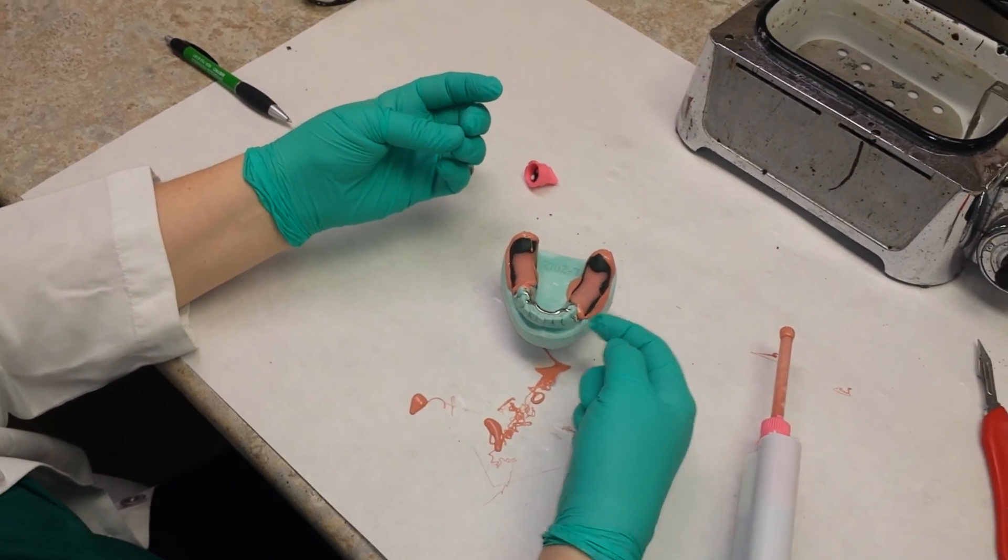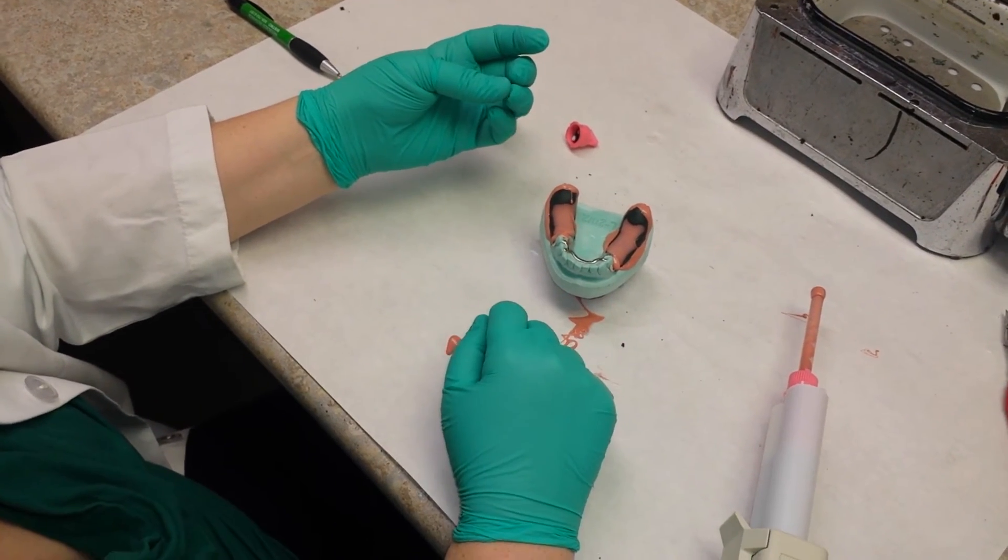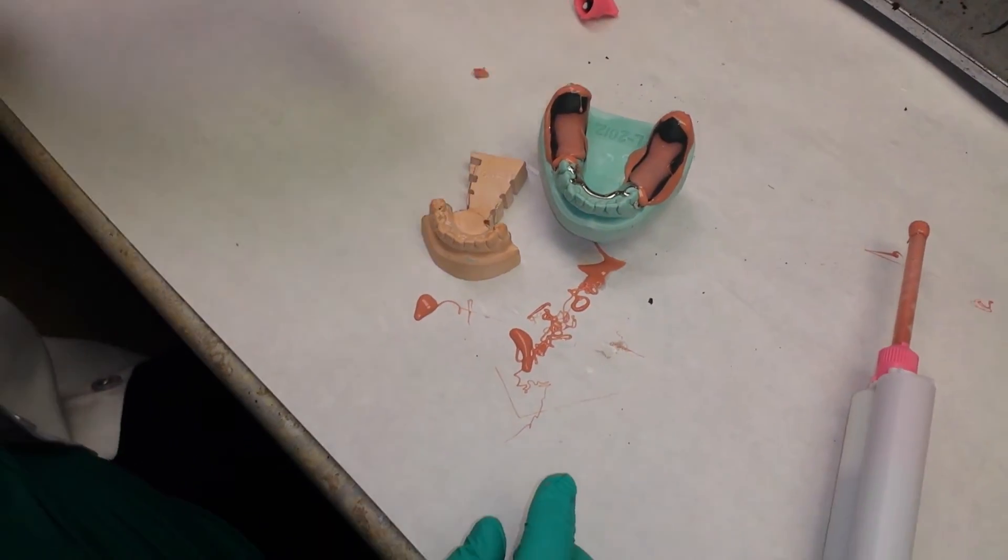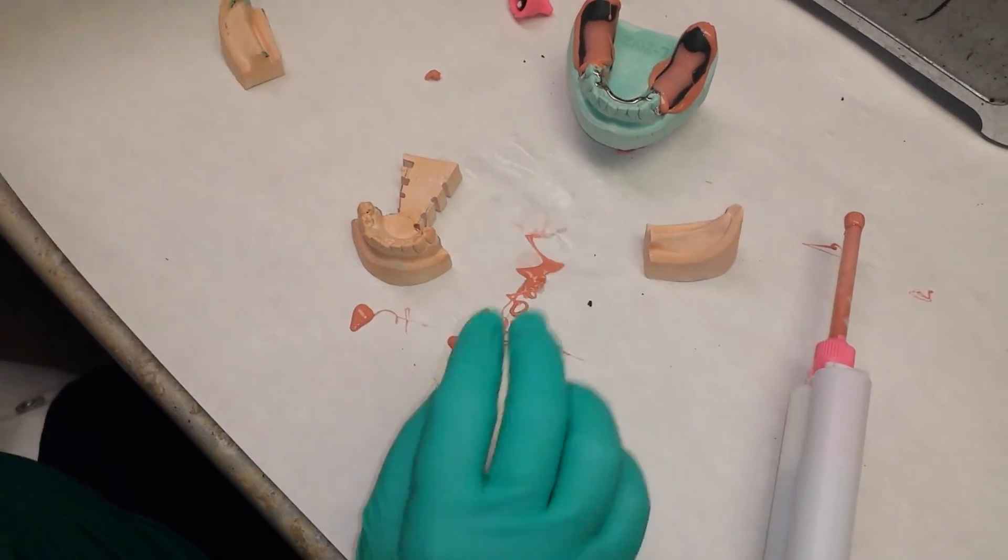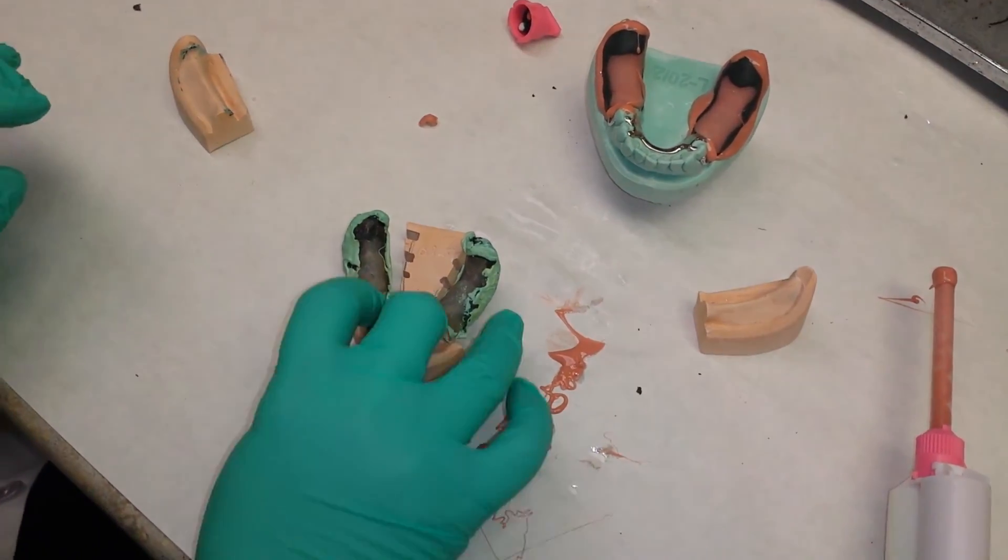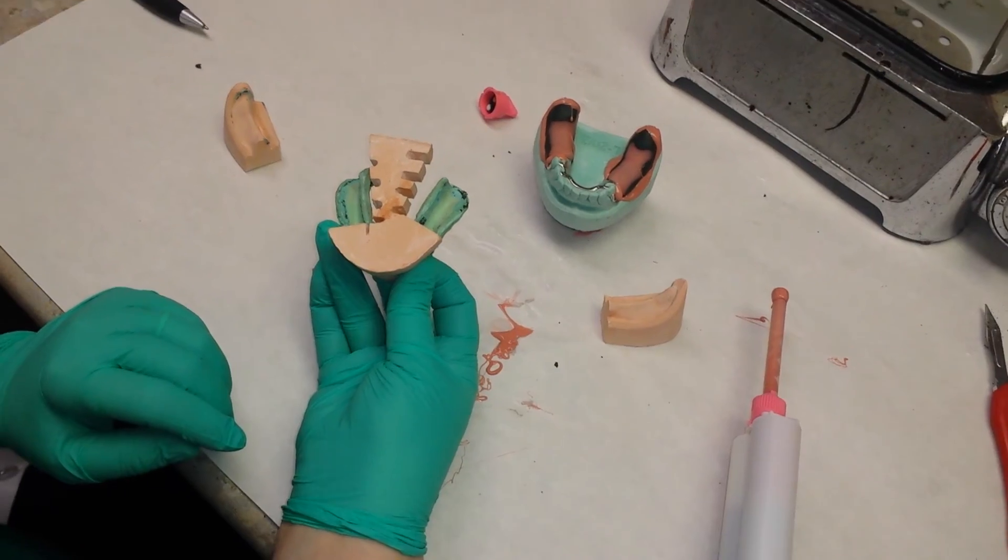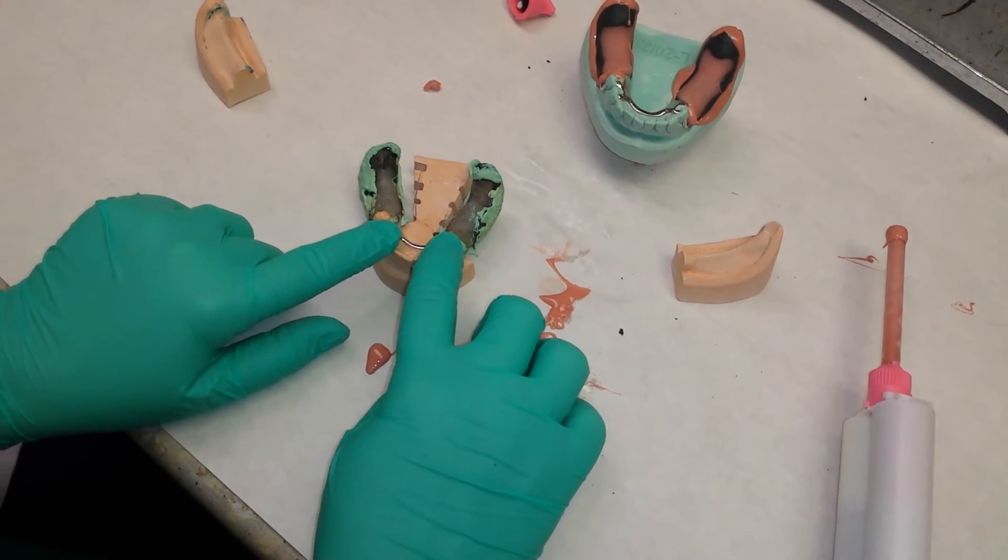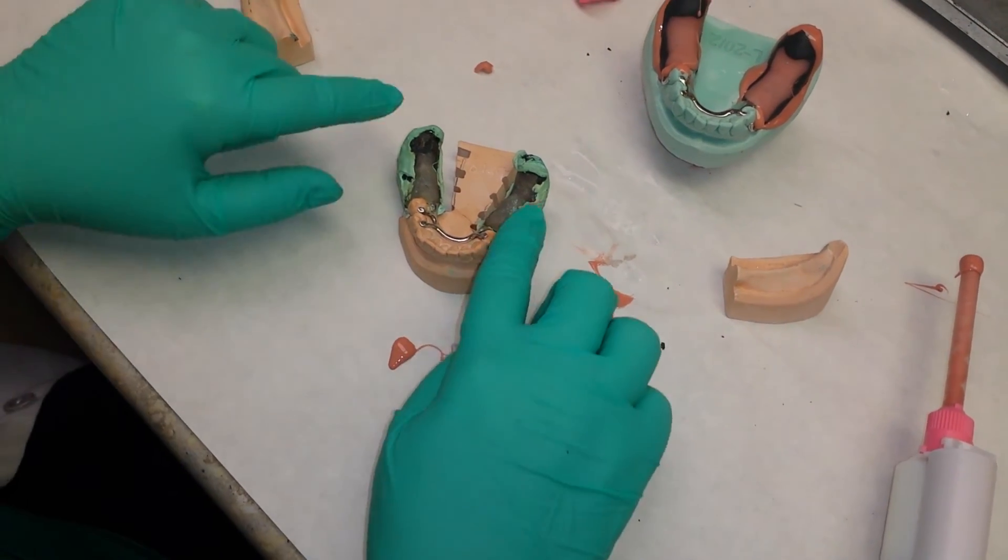Then the lab is going to cut the back portion of your definitive cast off and re-pour that area. That way the cast is being corrected, and you can kind of see that here where they're going to be cutting the posterior portion away. Once they cut that away, they're going to be placing this impression on there and turning it over and boxing it and pouring these new posterior areas. When you get it back, the metal framework is going to be clean and all of this posterior area will be off and you'll have a new impression in the back.